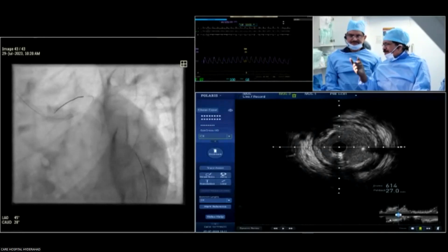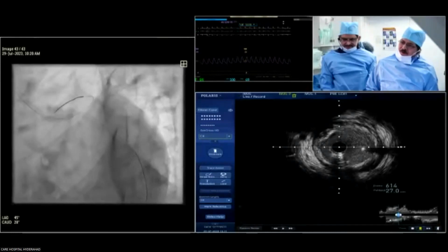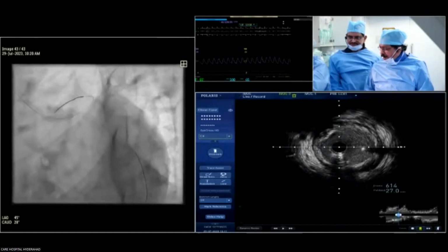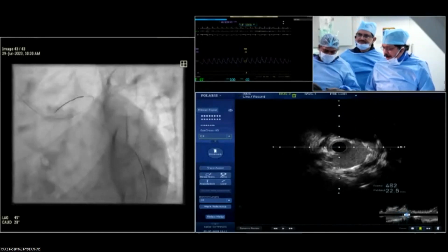Left main lane. Absolutely. So Dr. Surya Prakash will let you work a little bit, and we're going to move over to our next site here. Okay, carry on. We'll move over to our next site. Ajay has something to add on, so as we move, maybe Ajay can just comment, Dr. Kitane, as a quick comment before we move to our next site.